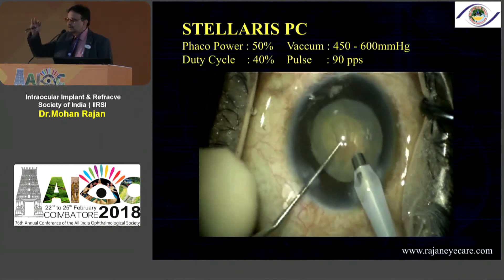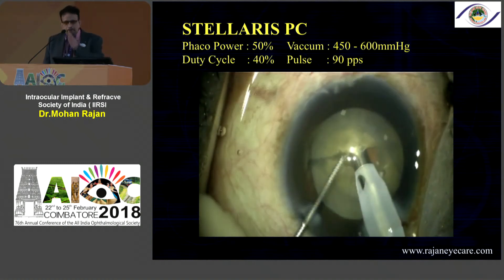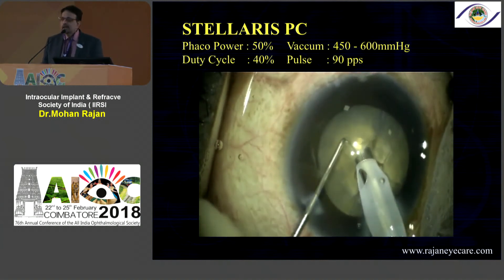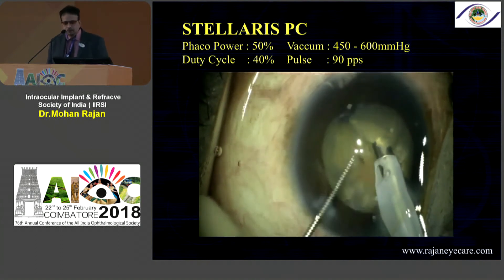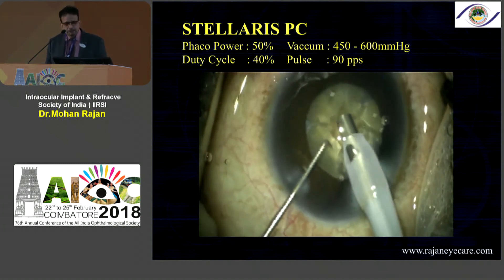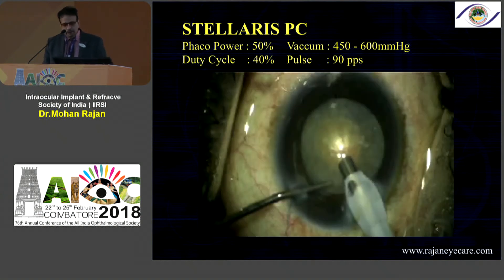In vertical chop, unlike horizontal chopping, you chop right in front of the rhexis under direct visualization. Keep the chopper straight, directed towards the optic nerve, and create a vacuum seal. In aspiration flow rate with a peristaltic machine you'll hear a sound when you reach the preset vacuum. In a venturi system the vacuum seal can be produced very quickly — the Stellaris PC — meaning any machine can be used for that matter. You can go bevel down, bevel sideways, or bevel up, whatever you're comfortable with. This is a vertical chop.